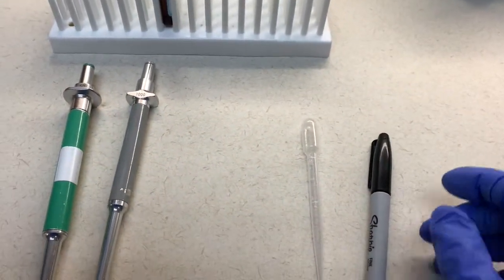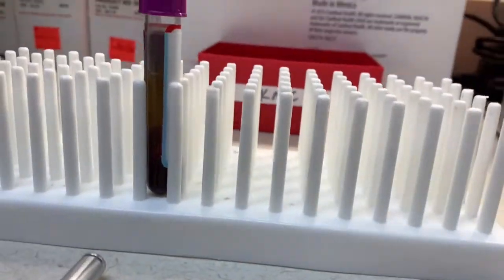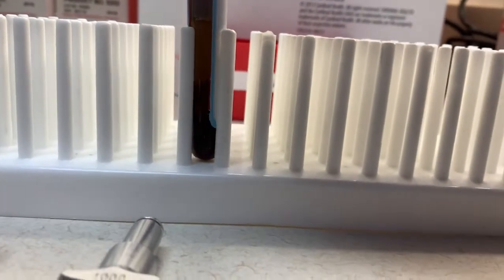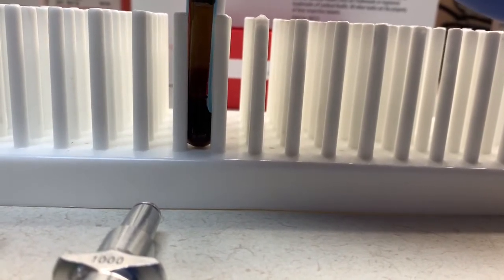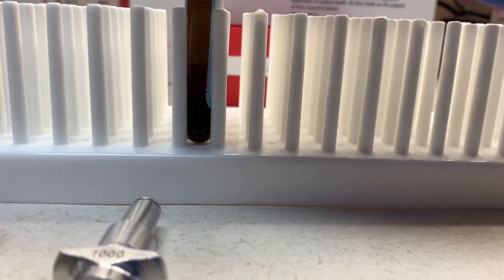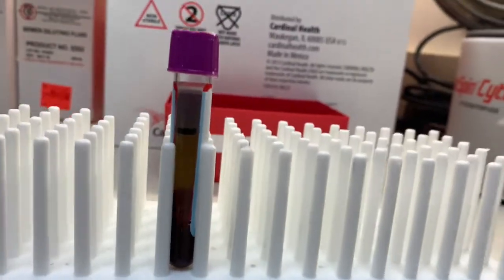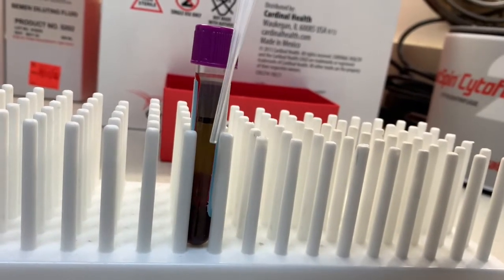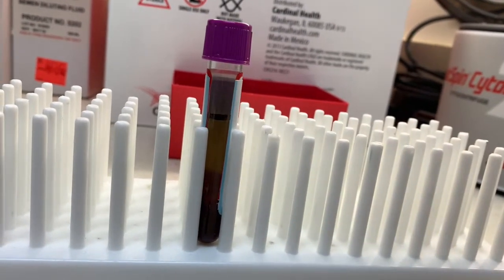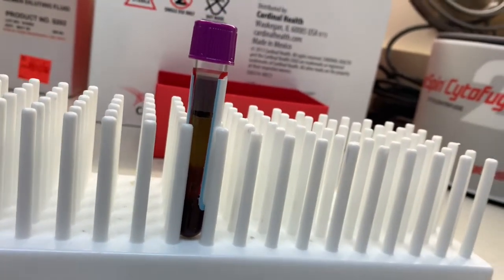Another nice trick that some people have shown me here that seems to work pretty well is you take a Sharpie. I might be doing this terribly because I'm trying to hold the camera too, but if you draw a line exactly at the top of the plasma, being as careful as possible, you can mark it, and then you can take one of these pipettes and remove all of the plasma off that way, so you'll have a mark of where you need to refill it back to. I'm going to try to do that off camera in just a second.